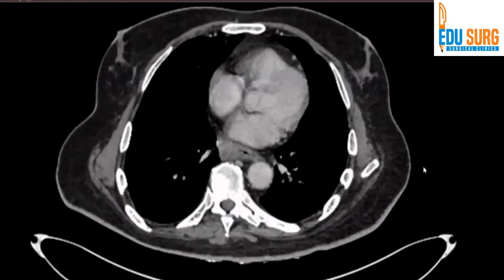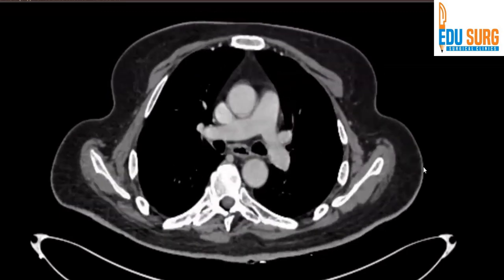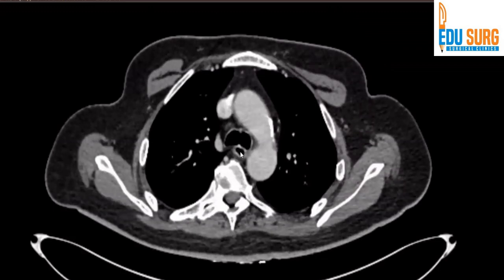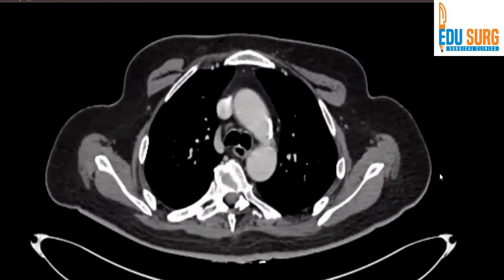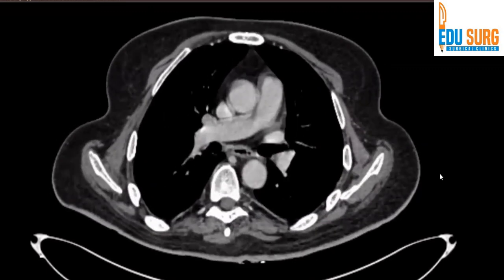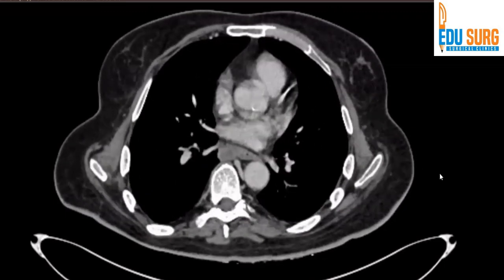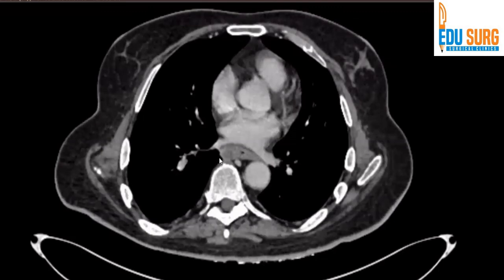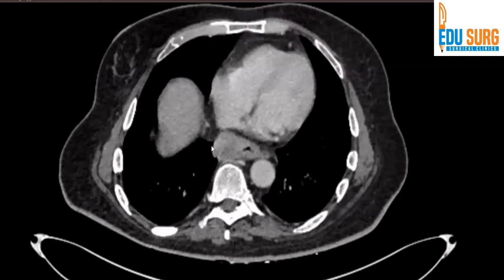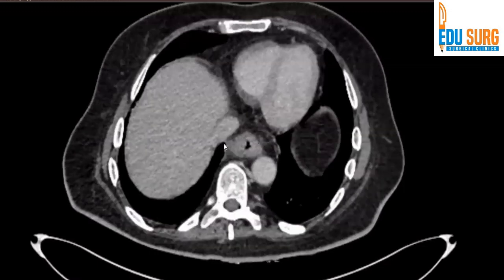As we go up, just to show you the normal esophagus — till the carinal bifurcation the esophagus is looking normal, but below it the thickening starts. You can see this entire thickening in the esophagus — thickening of the esophagus. Probably a nodal mass also.